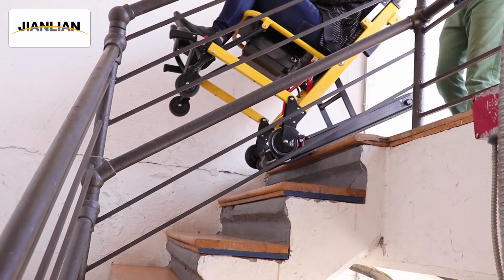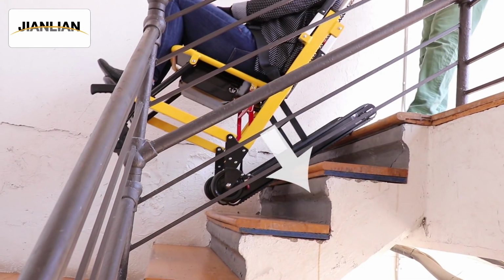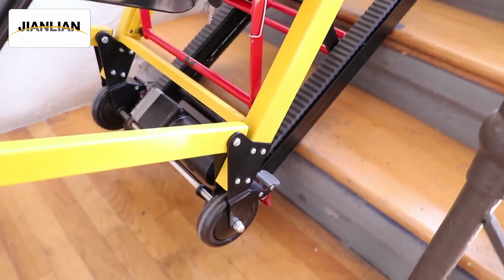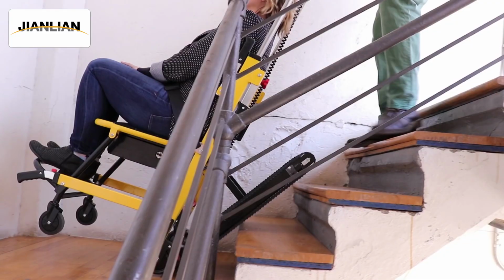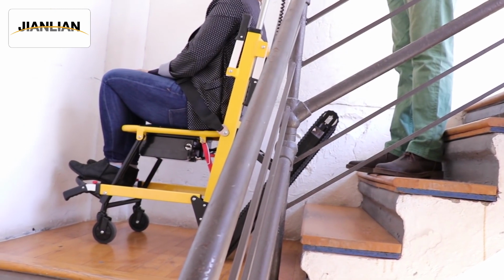Take care to pull the handlebar towards the stairs to keep the tracks pressed flush against the stairs. You should not be holding the weight of the stairlift in your hands. Once the back wheels of the stairlift touch the surface at the bottom of the stairs, use the handlebar to tilt the stairlift forward into an upright position.